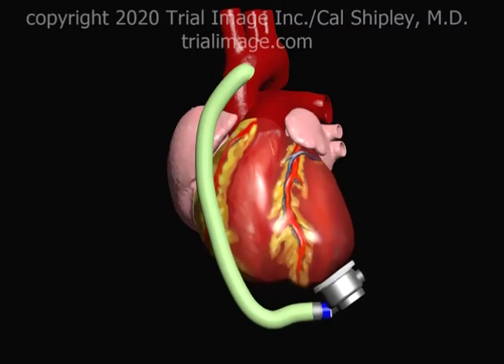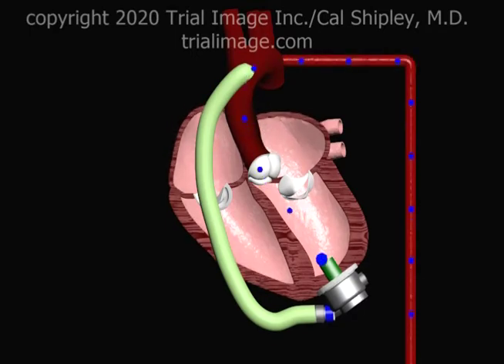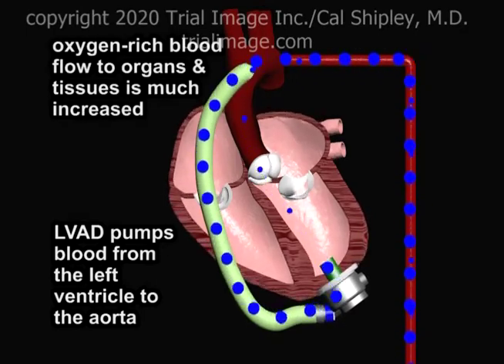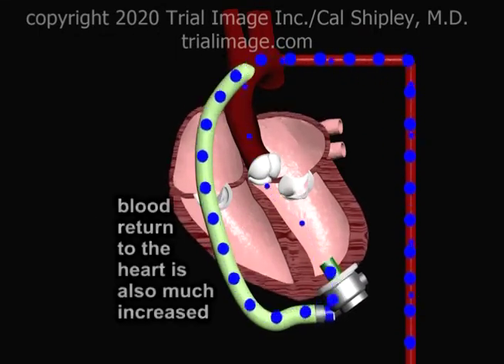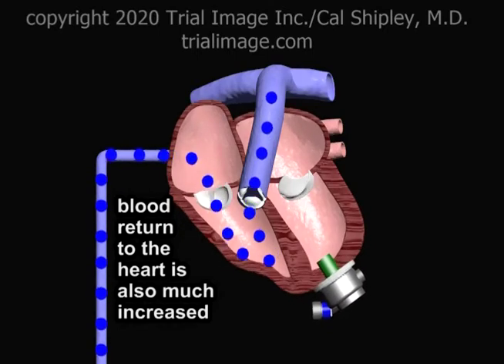Let's switch to a cross-sectional view of the heart to better understand how the LVAD works in left ventricular failure. The LVAD pumps blood from the impaired left ventricle to the aorta. As a result, oxygen-rich blood flow to organs and tissues, including the heart itself, is much increased. The increase in arterial blood flow is accompanied by a comparable return of venous blood to the right ventricle.